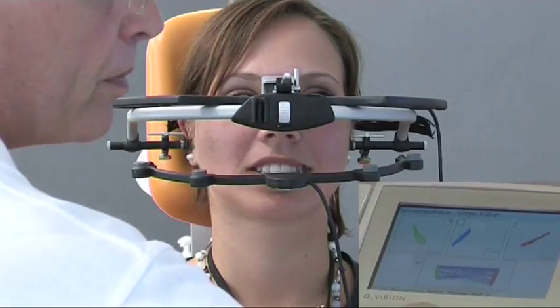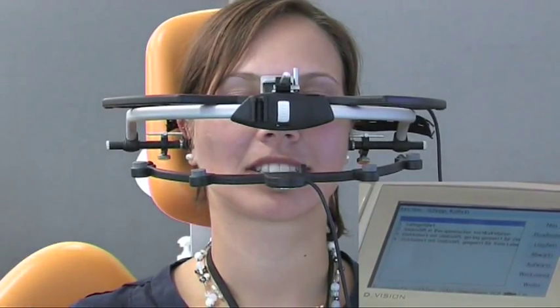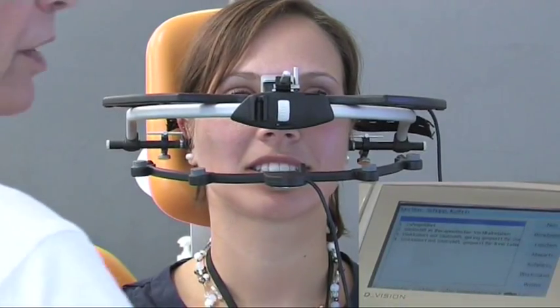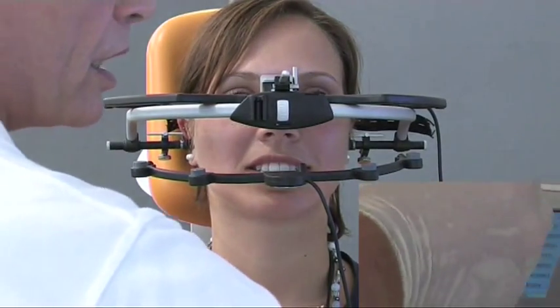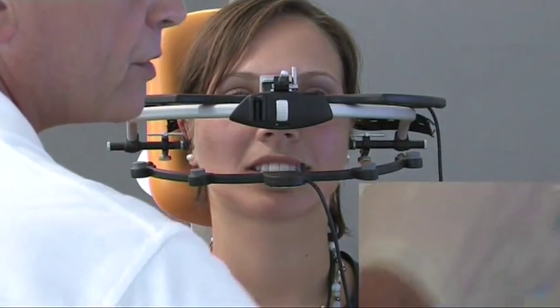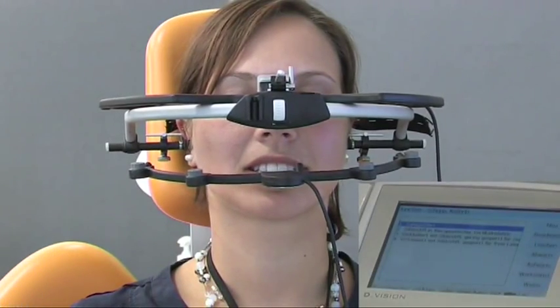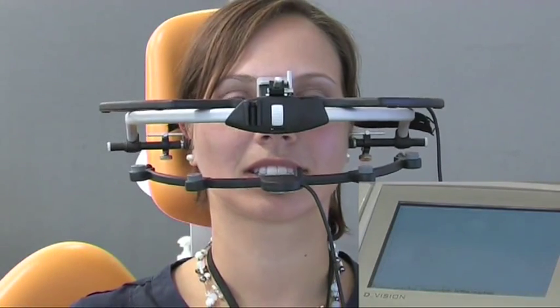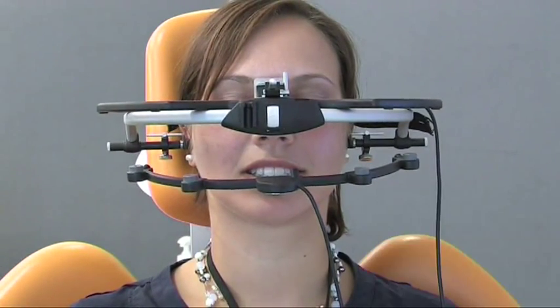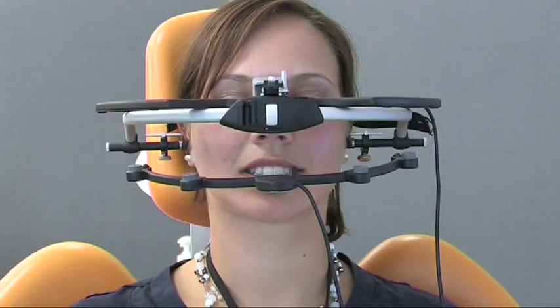After storing the last measurement, we can now include a comment. In this case, we select tooth guidance. The selection is confirmed by using the foot switch and sending the data to the computer.